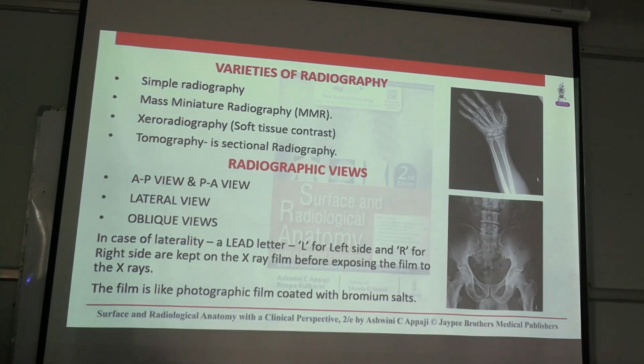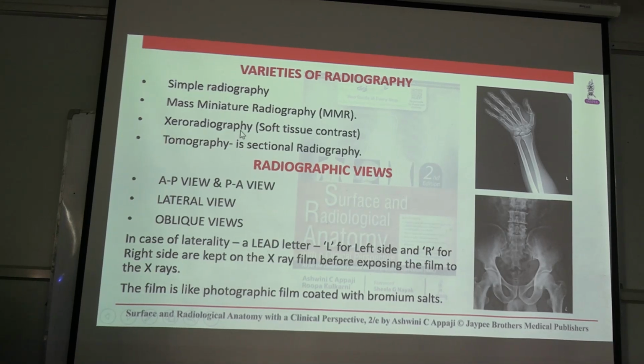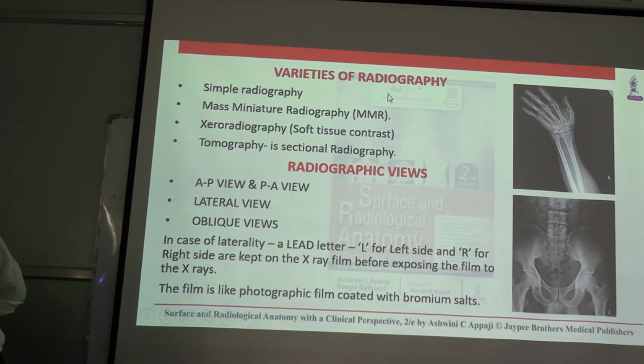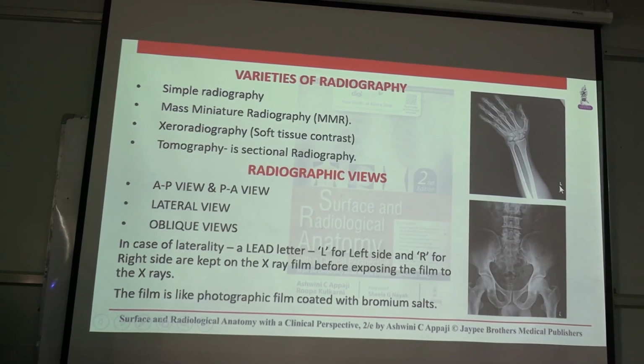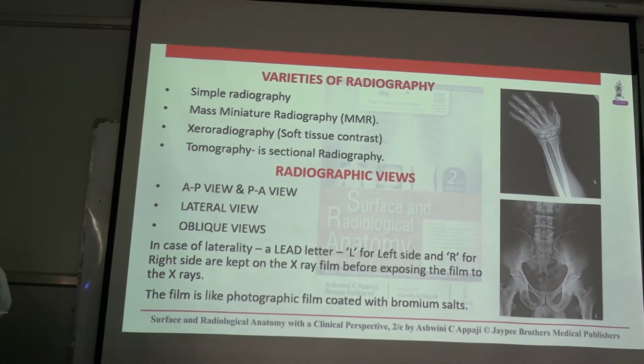Normally, in our examination, we give this particular AP view slides only. So we usually give AP views only, lateral views only for our examination. Now, if it belongs to the right side or left side of the body, we use this element as L or R. We have to mark it. If it is not marked, we are not going to comment, even though we understand.